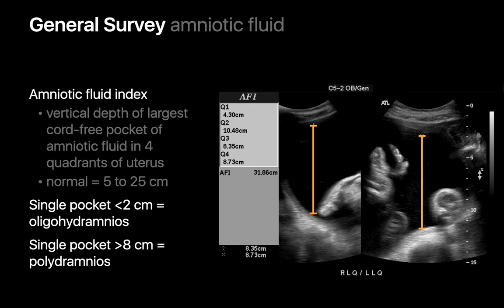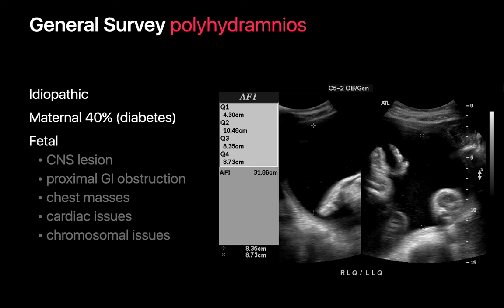In this case, the AFI is 31.86 and the deepest pocket is 10.48 centimeters, indicating polyhydramnios. Polyhydramnios is often idiopathic; however, around 40% of the time the cause will be maternal — such as maternal diabetes, renal, or cardiac problems. Fetal anomalies can be the culprit some of the time as well, and a few examples are illustrated on this slide.